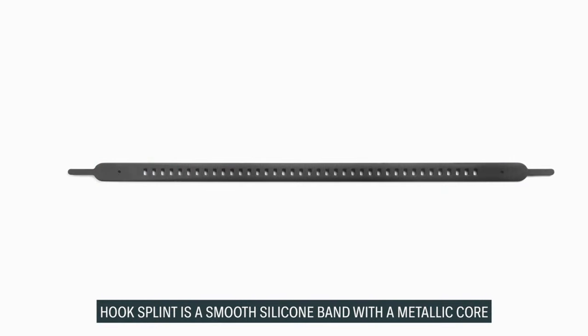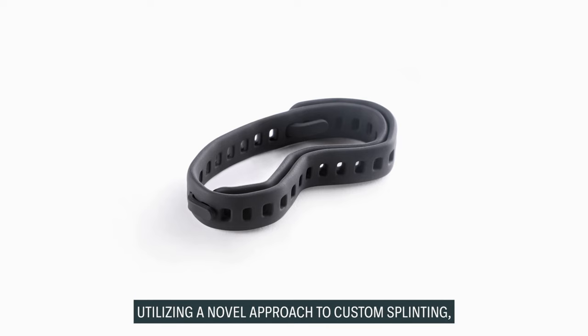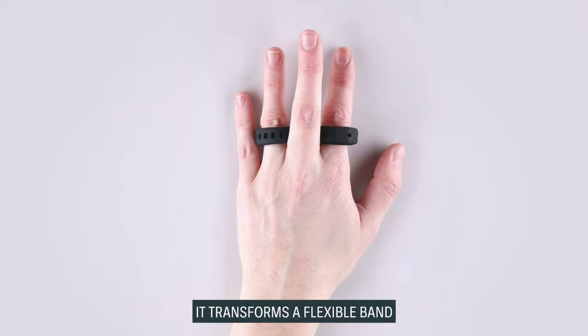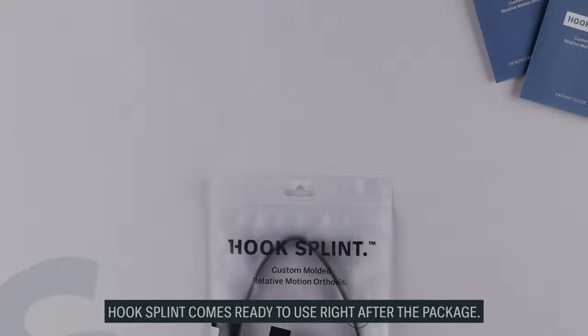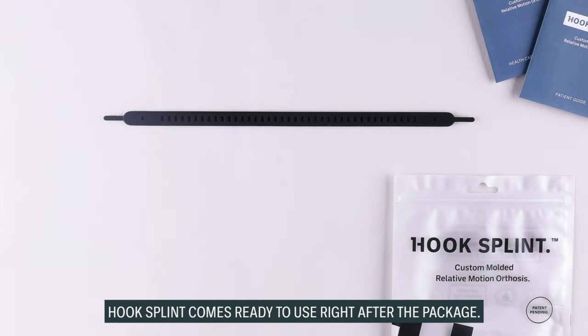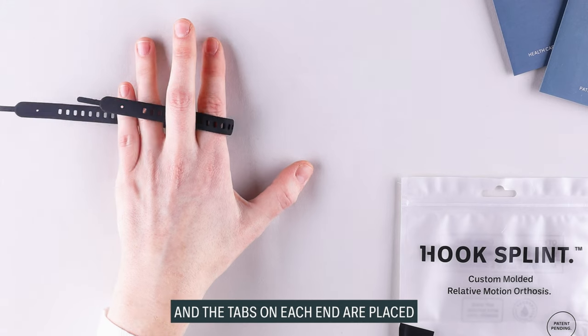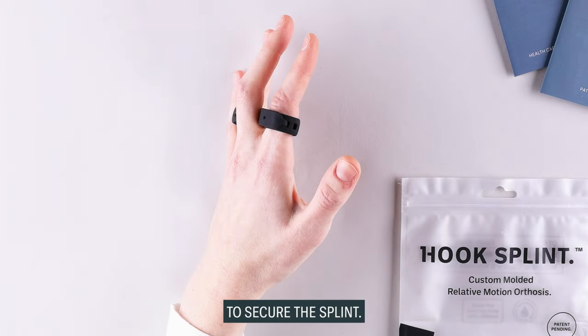Hook Splint is a smooth silicone band with a metallic core, utilizing a novel approach to custom splinting. It transforms a flexible band into a rigid custom orthosis. Hook Splint comes ready to use right out of the package. It is molded directly to the patient, and the tabs on each end are placed through the perforations to secure the splint.